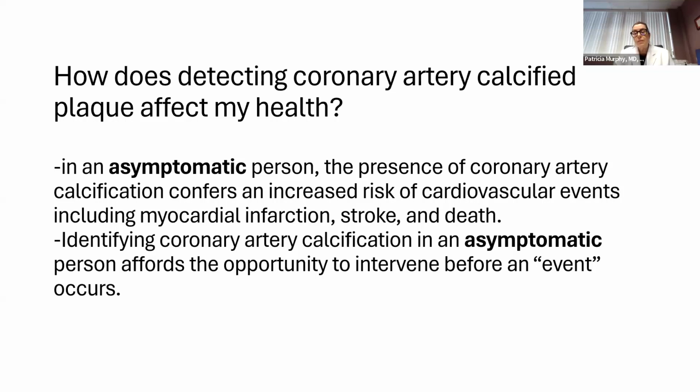So it's important that if you have a positive coronary calcium score, you consider it to be a good thing in a way. You wish your score was 0, but if you do have calcification, it gives you the opportunity to make significant lifestyle and medical changes to improve your life and reduce your risk.